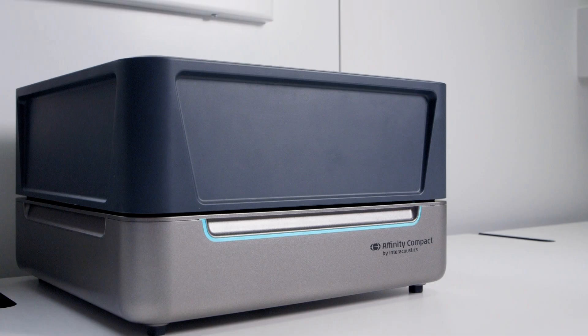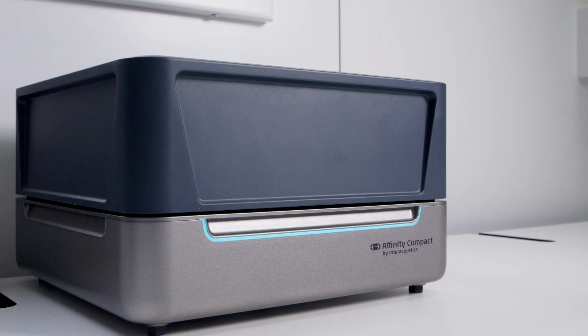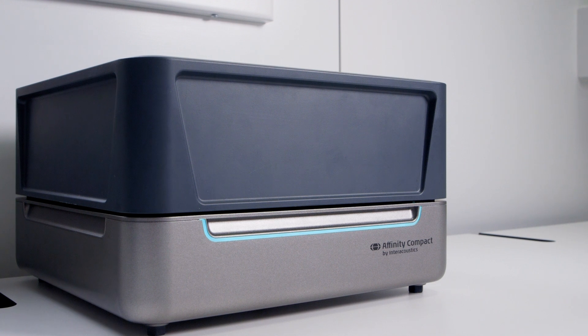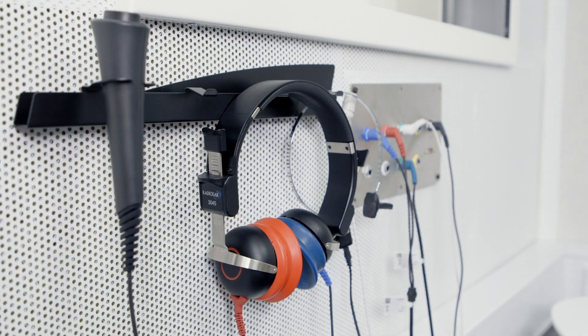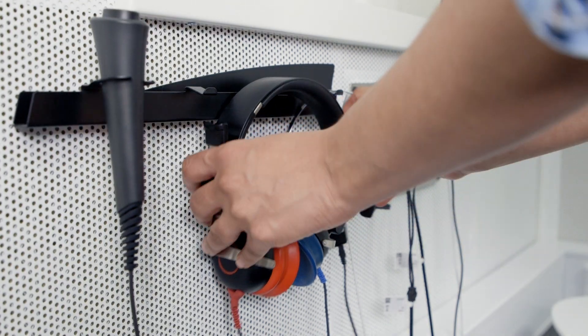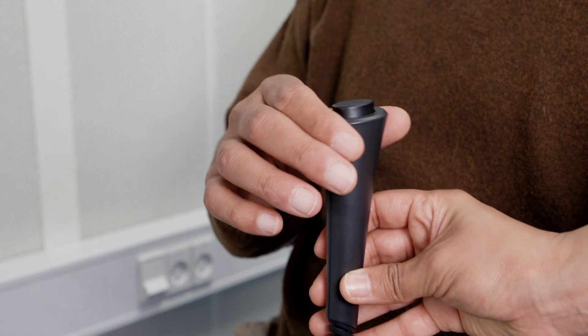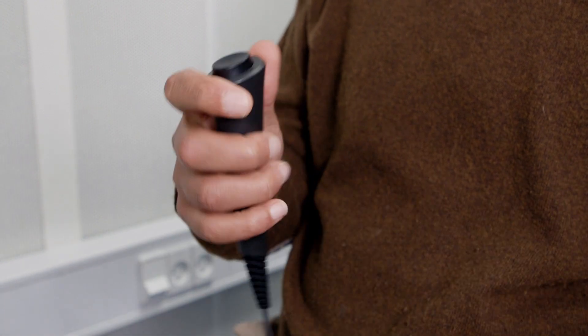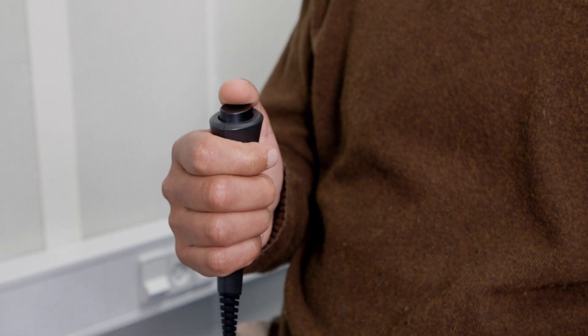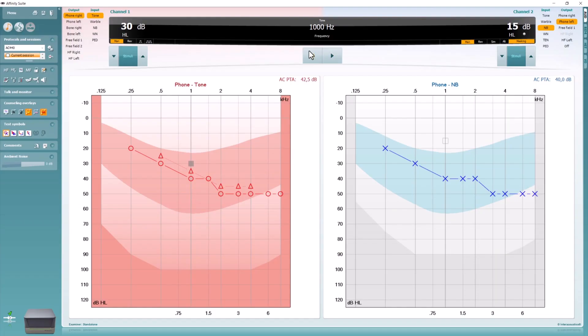To perform ACT, you will need an audiometer with the ACT license, headphones or insert earphones, a patient response button, and a completed binaural audiogram with thresholds stored for at least the following frequencies.